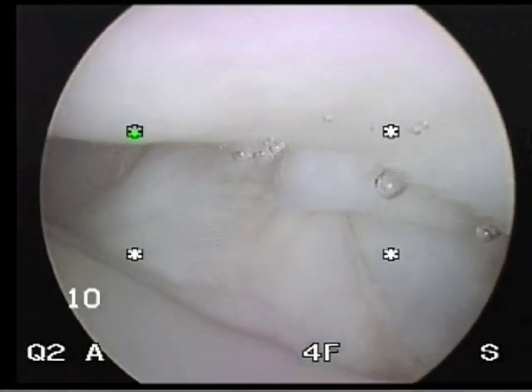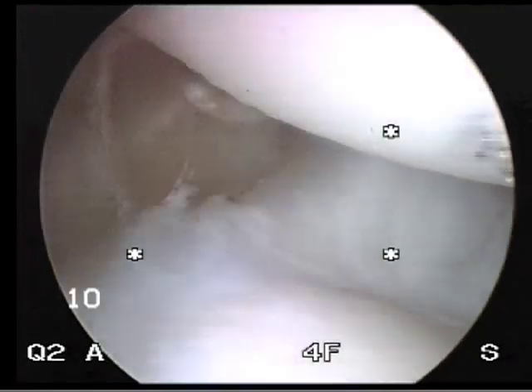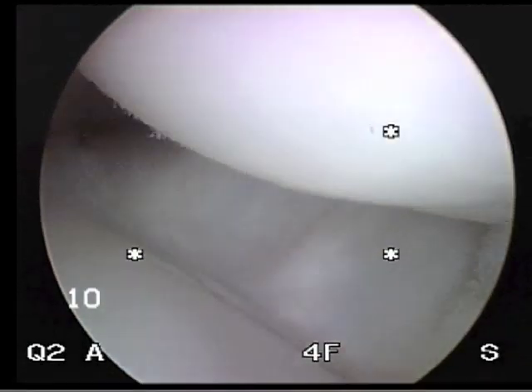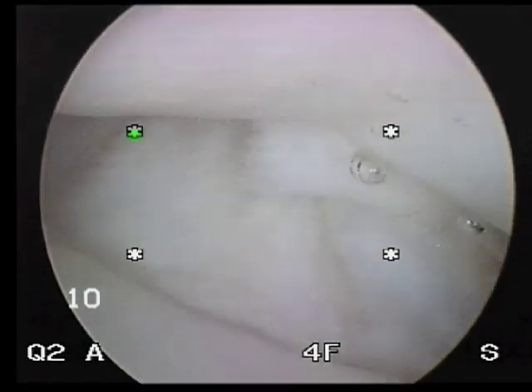So here on this video you can see direct visualisation of the articular structures, and here are some of the white bones lined with articular cartilage, joined together with these strong stout ligaments. This gives the surgeon invaluable information about the inside of your joint and how it's working in real time under direct vision.